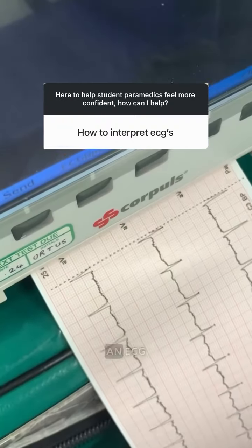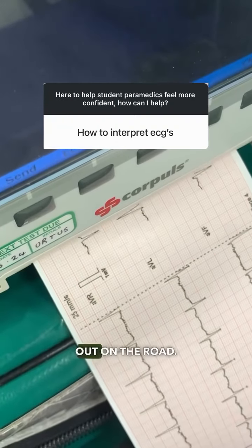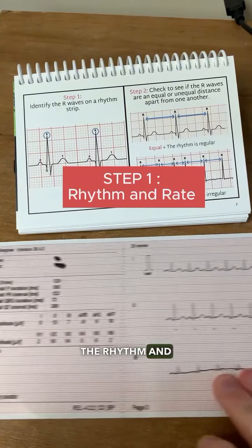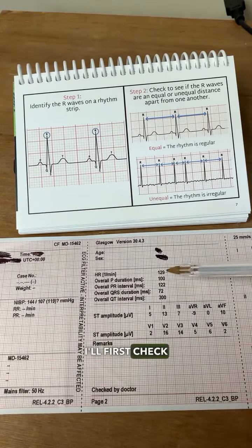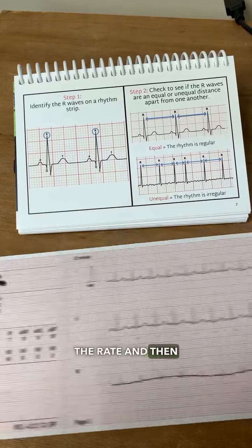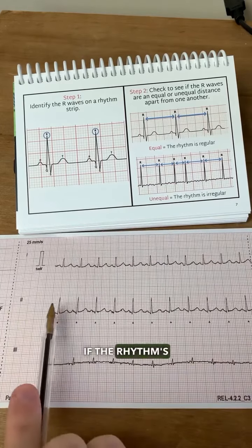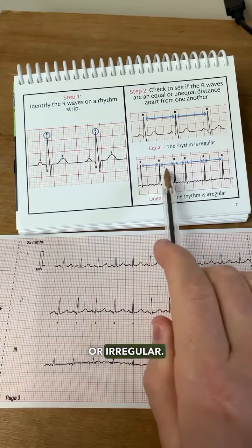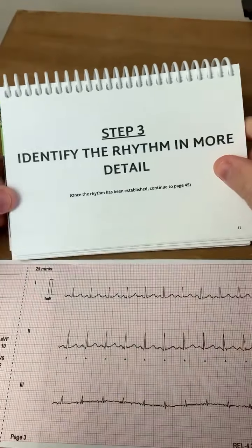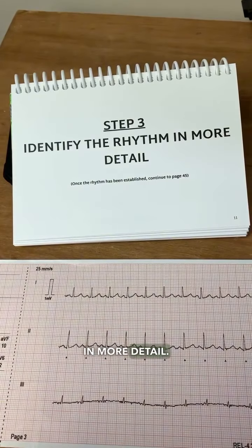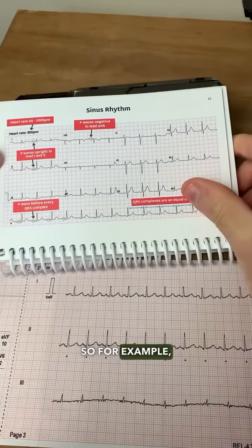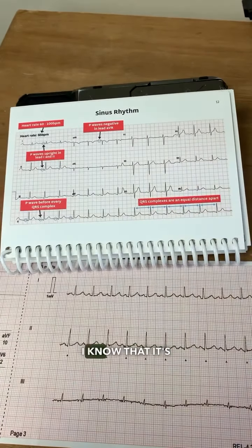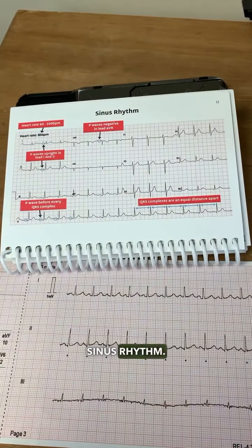Here's what I look for when I'm assessing an ECG out on the road. Step 1: the rhythm and rate. I'll first check the rate and then assess to see if the rhythm's regular or irregular. I'll then look at the rhythm in more detail — for example, if I see this criteria, I know that it's sinus rhythm.